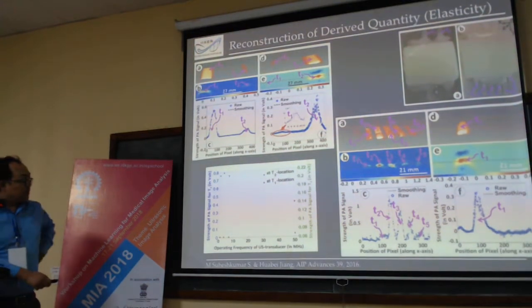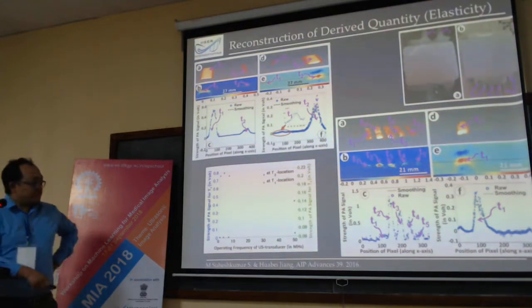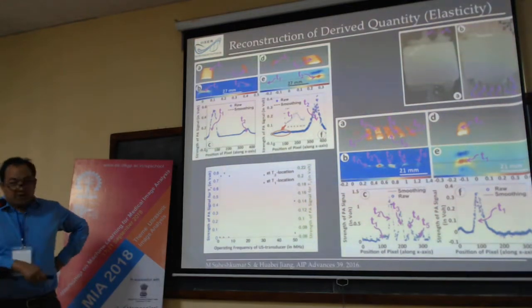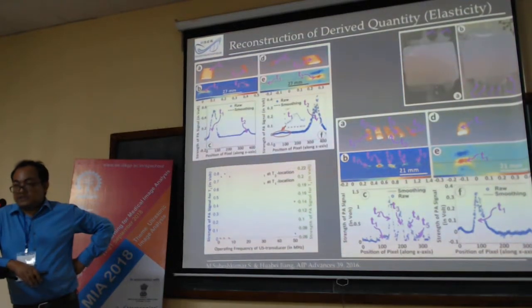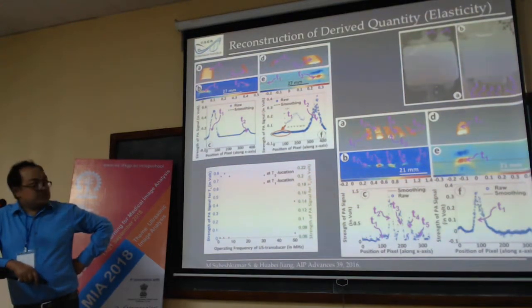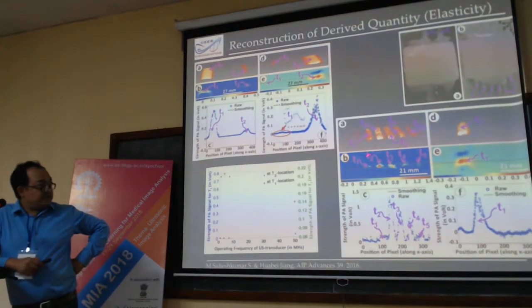Yes, one more thing. The frequency response that we use for detecting the different physical parameters is quite different, and I would like to share that with you. For optical absorption, the lower frequency range of 1 to 10 or 15 megahertz is more suitable, but that cannot be used for detecting the elastic property. For that, we used 50 megahertz. This is also very nice to share with you.